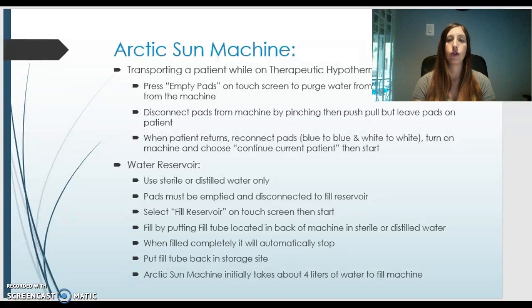When a patient returns from their tests, you would reconnect the pads and you would look at the cords and it's blue to blue and white to white. You would turn back on the machine and choose continue current patient and then hit start to restart the therapy.